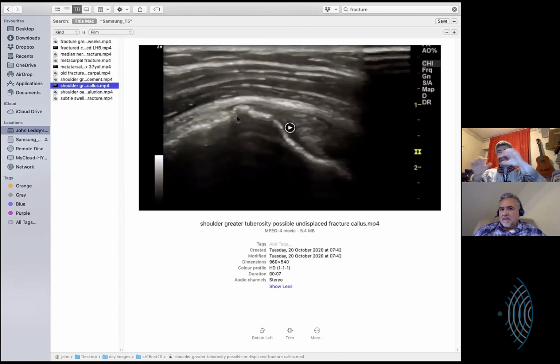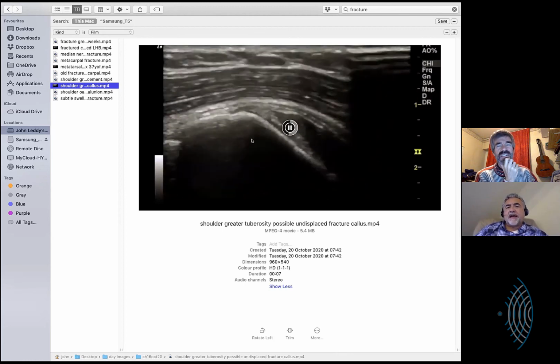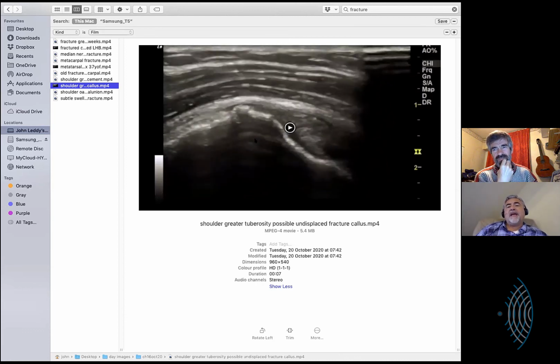It's too linear and too much there for me to think it's just a malformation of the bone outside of the joint, which you can get. You're able to follow the fault in the bone in far enough that you say this can't be something that was just a spur or an osteophyte or something like that.